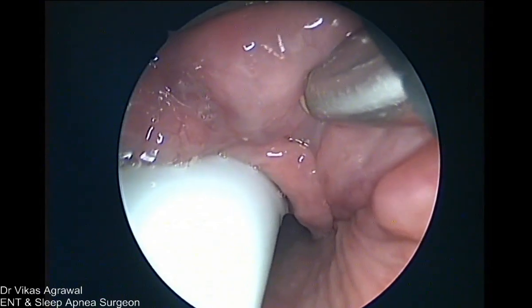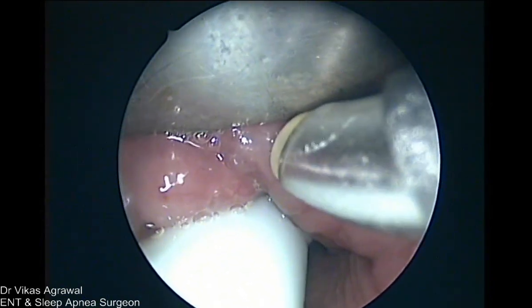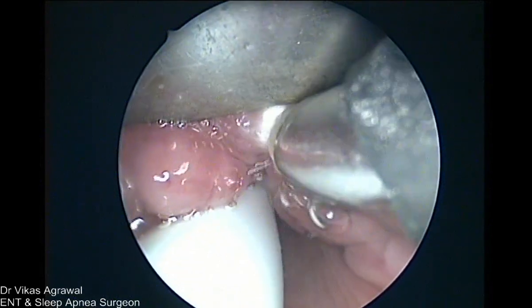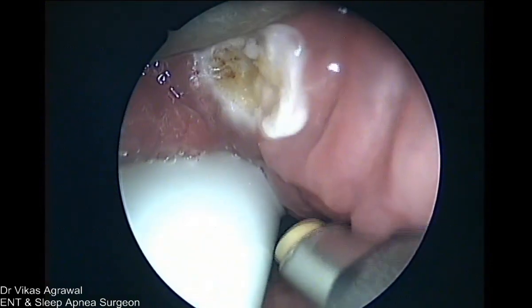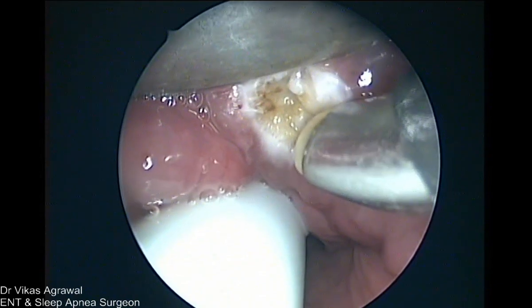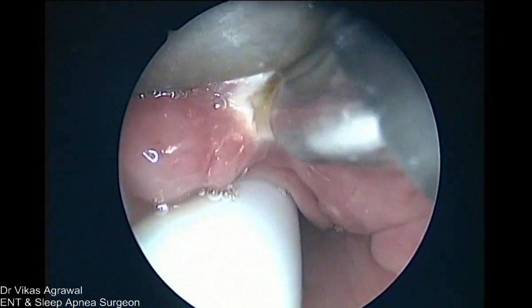You can see the epiglottis. Seen. And remove all this tissue. Don't move. Now what will happen? You can see the saline. Saline will go into the larynx. Kalpesh, are you okay with the saline passing into the larynx? So saline is absolutely all right. Blood is not all right. So if required, we'll keep a very small throat pack.